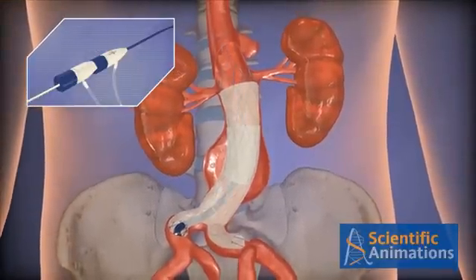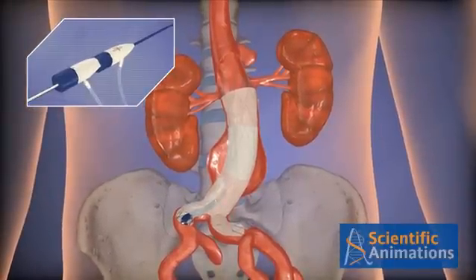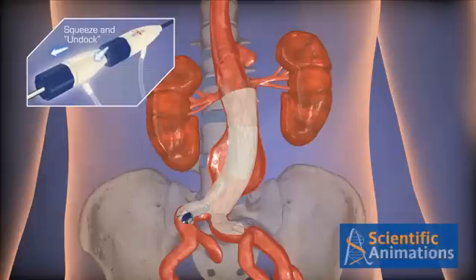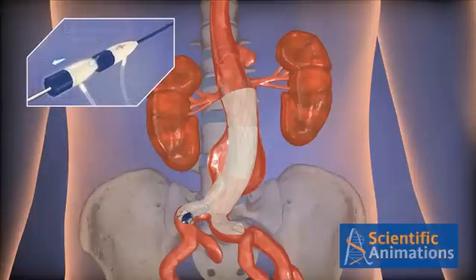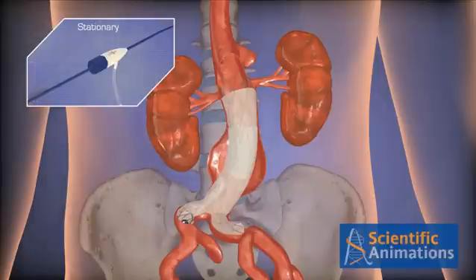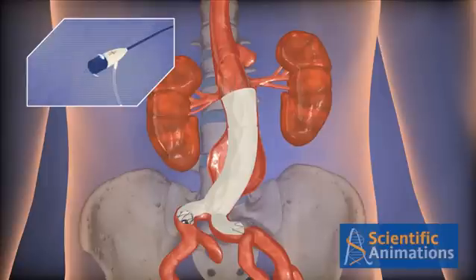To remove the accessory system, pull the tip back into the sheath. Squeeze the lock and dock handles to release. Then retract while maintaining the position of the introducer sheath. Tighten the hemostasis valve.